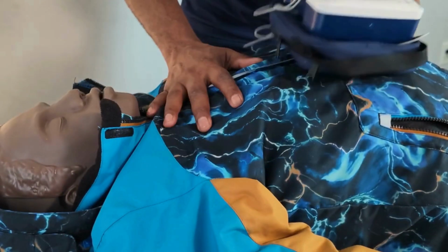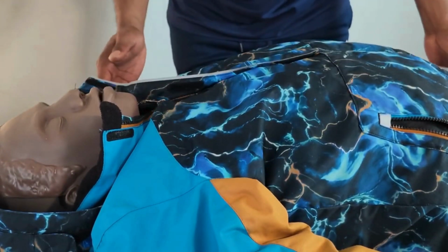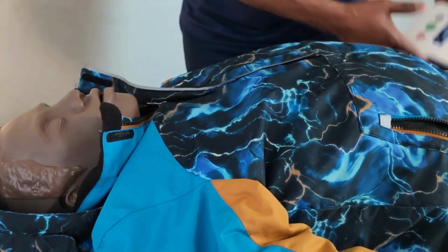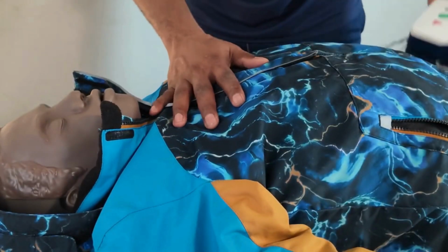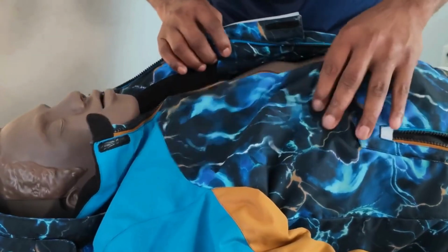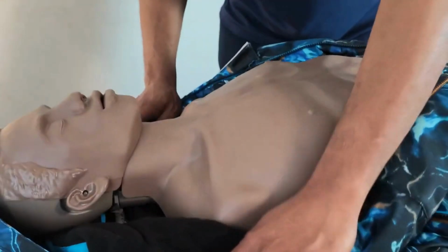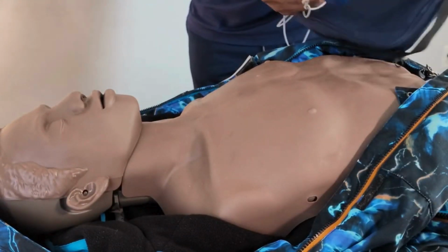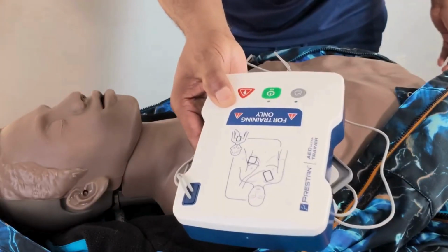So you have a person over here on the floor who has collapsed. You want to help the person. You have grabbed your AED, and the person has clothes on. So first, just remove the clothes.